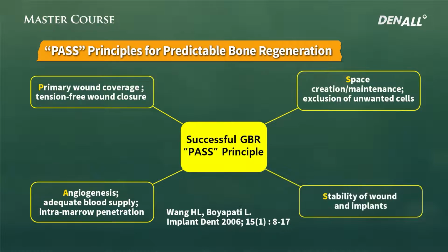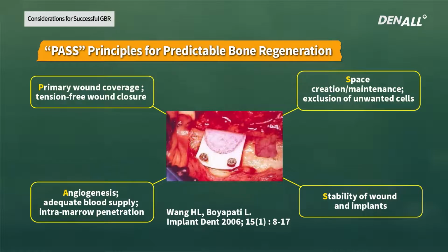and implants. In order to make a solid bone, you need to fixate a membrane stably. As you can see, after you apply the membrane, using bone tack, the membrane is fixated.